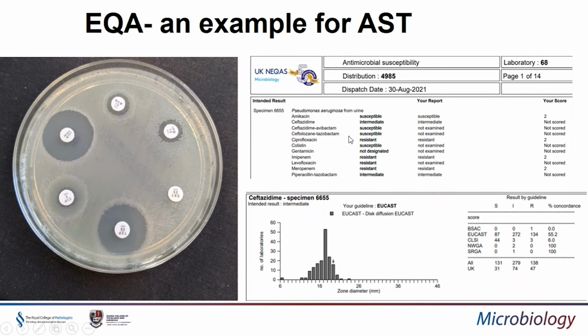We did actually get them all correct. But again, it comes down to ceftazidime. We had this one down as I, which is not on this plate. I is not intermediate, it's susceptible, increased exposure, but we weren't scored on this. We also weren't scored on piperacillin tazobactam, which would be this one. We called this one I, susceptible increased exposure, but again we weren't scored on this one either.